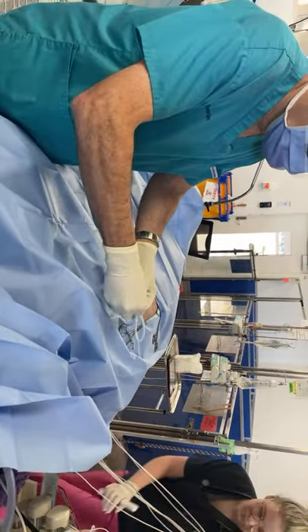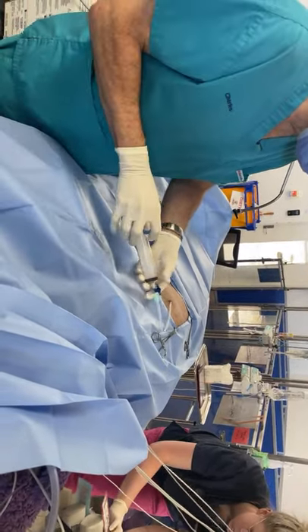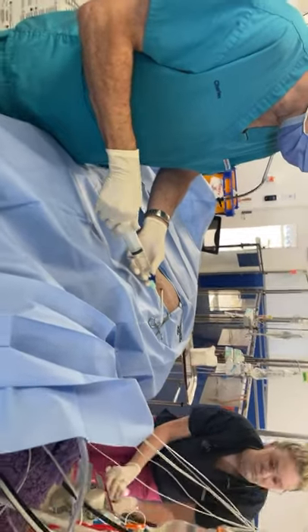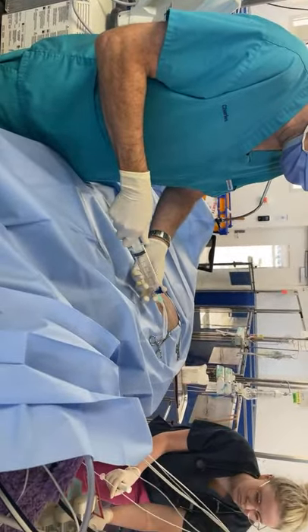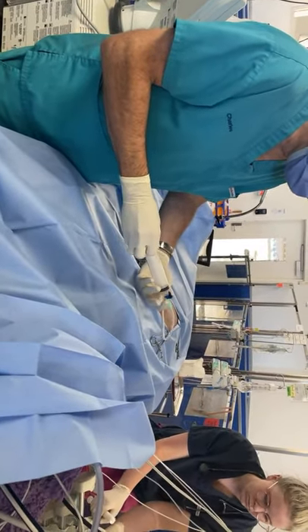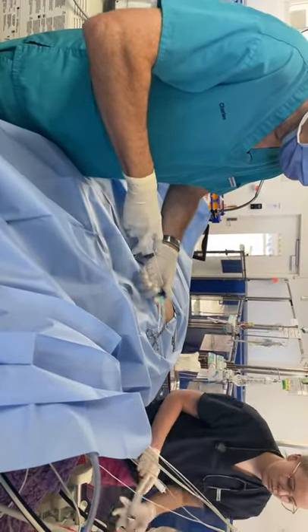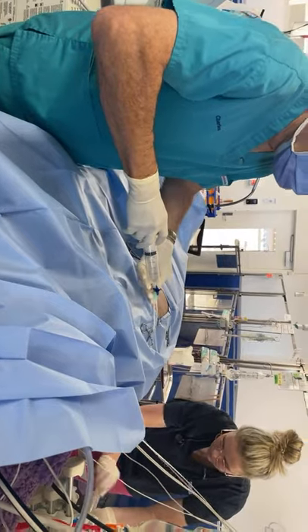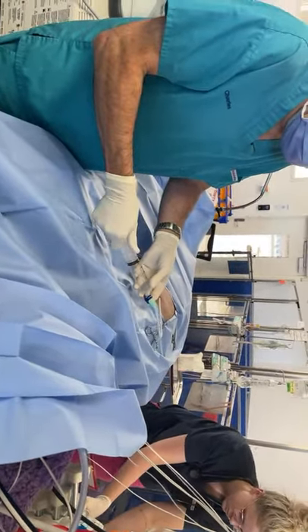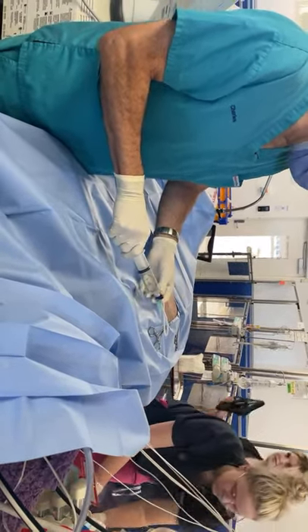What I'm going to do is inject some air into the chest to blow off any soft tissue, then aspirate it again and see if I get the same amount back. I'm taking 50 mls of air, injecting it into the chest, then aspirating it back out — and I'm getting about that same 50 back, which tells me the chest is negative at this point.